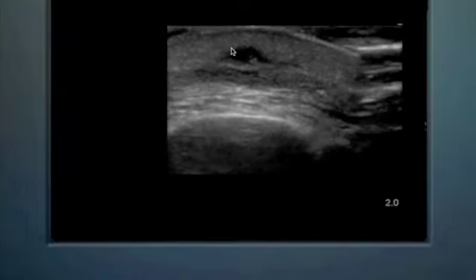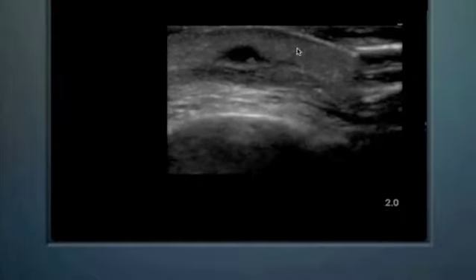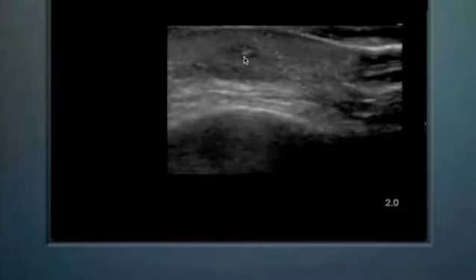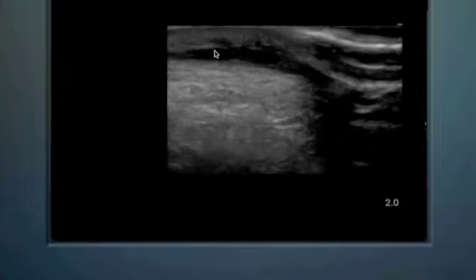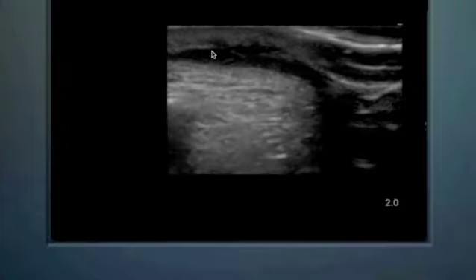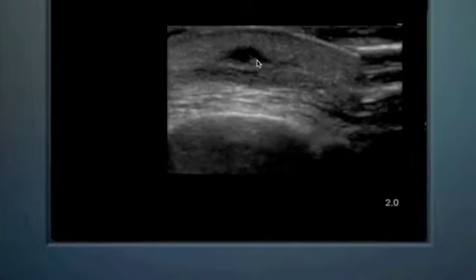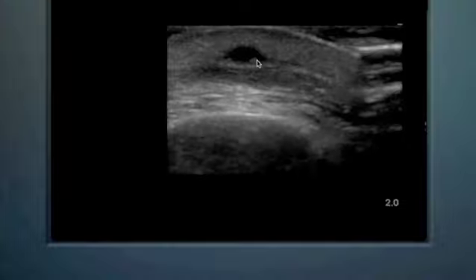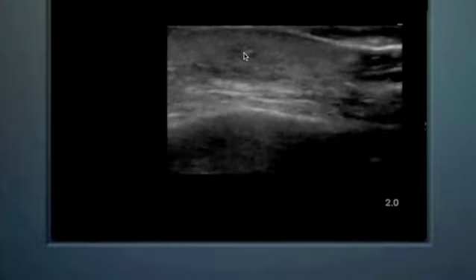This patient has a very, very small abscess. This is actually their eyelid coming along here, and this is a lacrimal gland, which normally is not seen to this degree. In this patient, a very swollen eyelid, and we can make out that small amount of abscess here with a little pus inside of it there. And this required just a quick lancing in order to drain this abscess.